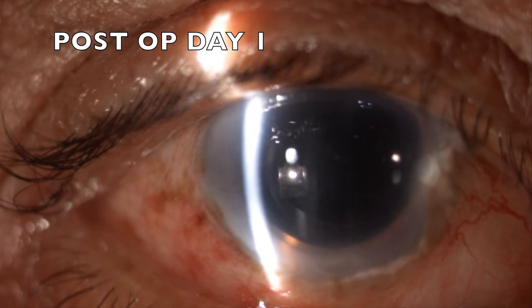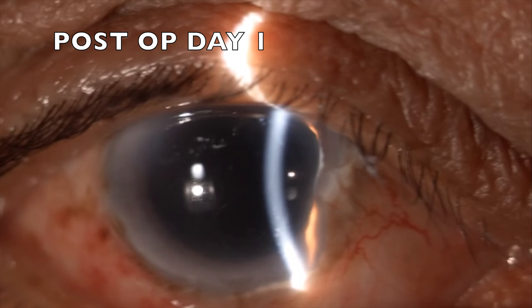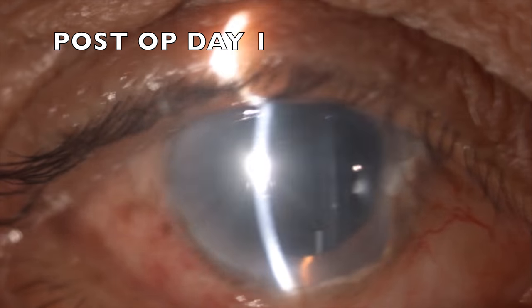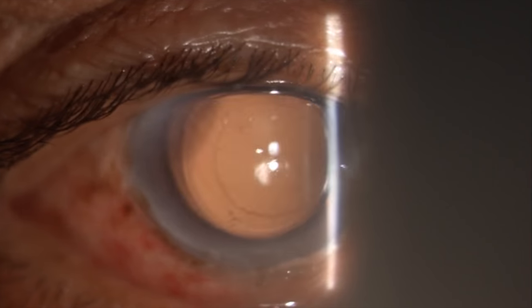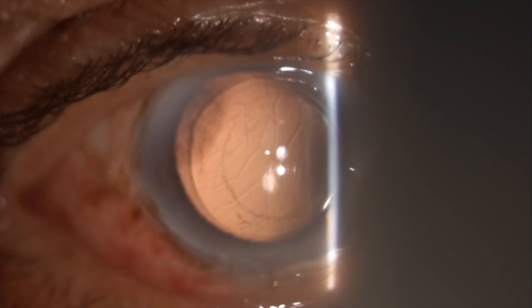On the first postoperative day, the patient has an unaided vision of 6/36, up from a preoperative vision of counting fingers at 2 meters. There is some mild corneal edema as you can see in this retro-illumination picture — there are some Descemet's membrane folds — but these will clear up within a week postoperatively.